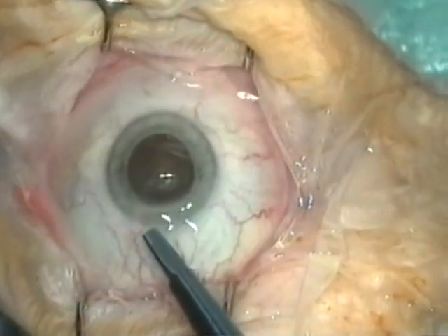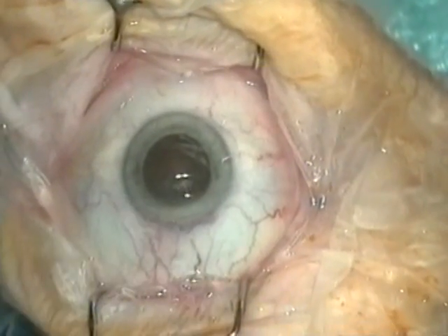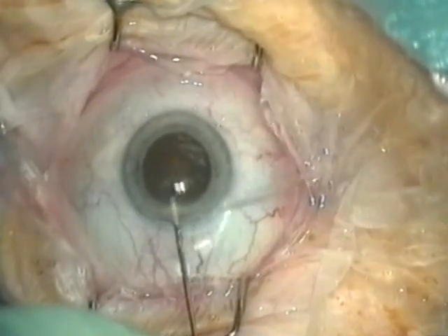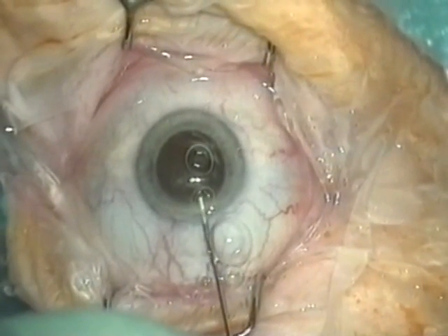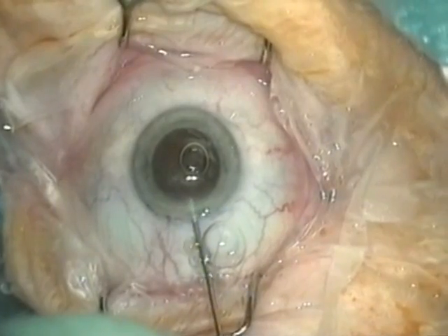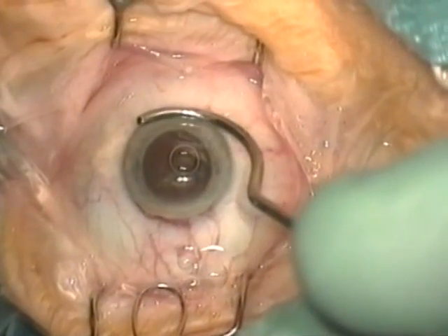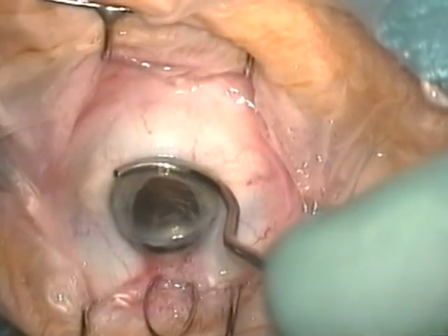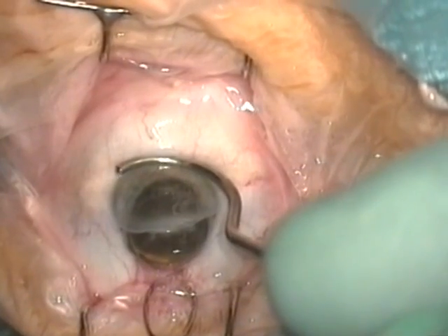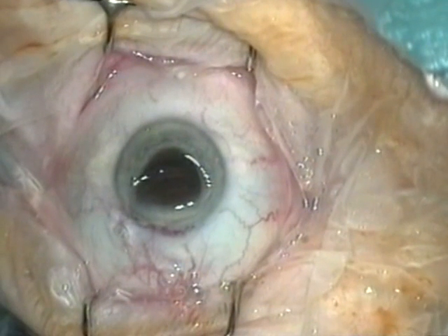In this particular case it became obvious that the incision was not complete on the inside. Always remember to fill the anterior chamber with viscoelastic first before expressing the nucleus. Once the incision was completed the nucleus came out easily. Note again the position of the expressor and the loop — the expressor is at the lower limbus and the loop is well away from the incision and above it. The pressure from the lens expressor should stop as soon as the nucleus starts to come out of the eye.